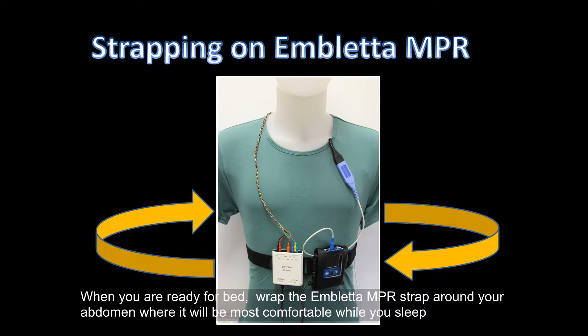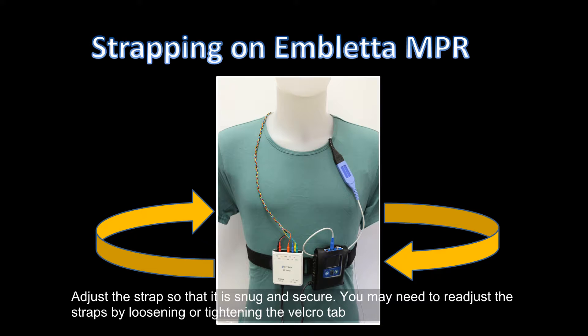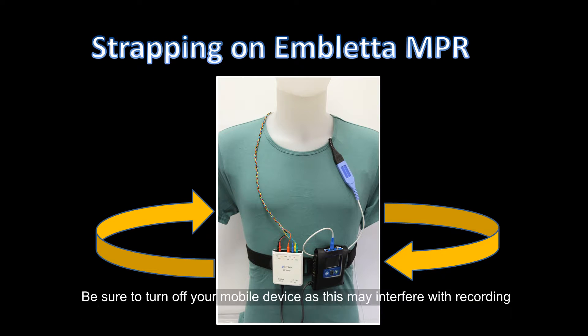When you are ready for bed, wrap the Embletta MPR straps around your abdomen where it will be most comfortable while you sleep. Adjust the strap so that it is snug and secure. You may need to readjust the straps by loosening or tightening the Velcro tab. Be sure to turn off your mobile device as this may interfere with recording.